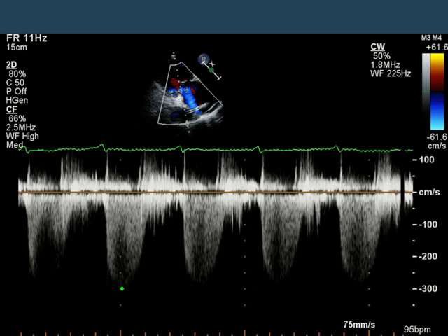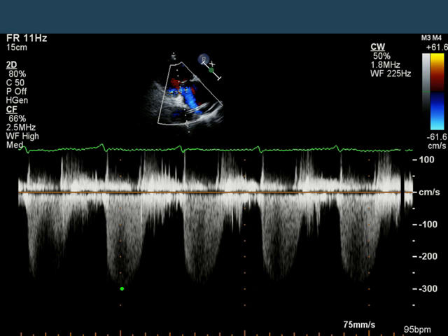This is a Doppler of the tricuspid valve in the same patient. You can see that the peak tricuspid regurgitation velocity approaches three meters per second, so you can assume that the patient probably has mild to moderate pulmonary artery systolic hypertension. If the right atrial pressure were 10 millimeters of mercury, we would be talking about a pulmonary artery systolic pressure of approximately 46 millimeters of mercury. And the tricuspid regurgitation signal, unlike its mitral counterpart, starts exactly when it's supposed to — with the onset of electrical systole, right after the QRS.